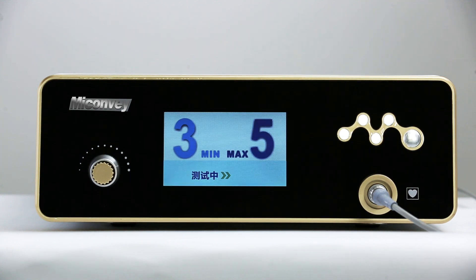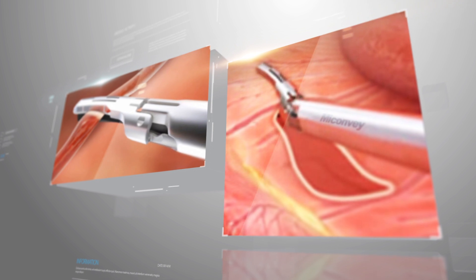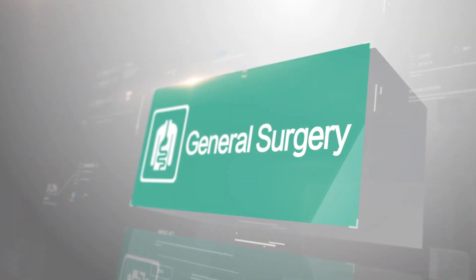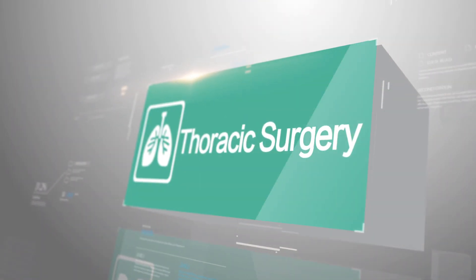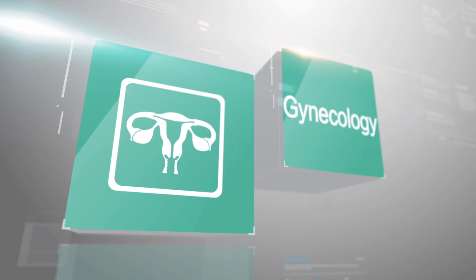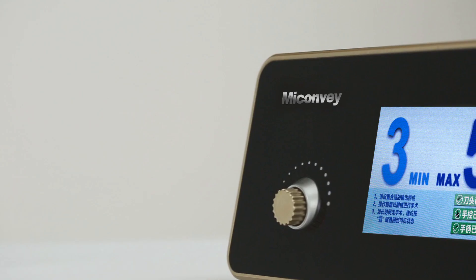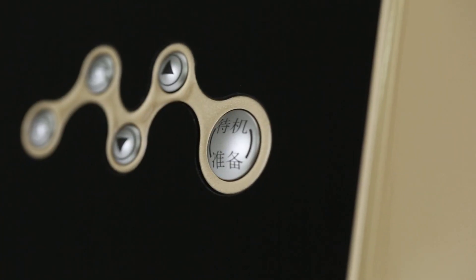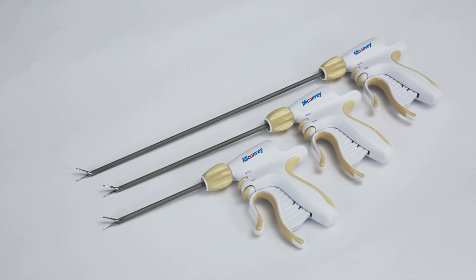The Autoforce Ultrasonic Surgical System is suitable for dissection and haemostasis in open and laparoscopic surgery, including general surgery, urology, thoracic surgery, and gynaecology. It provides accurate, efficient, intelligent, and stable intraoperative operating experience.